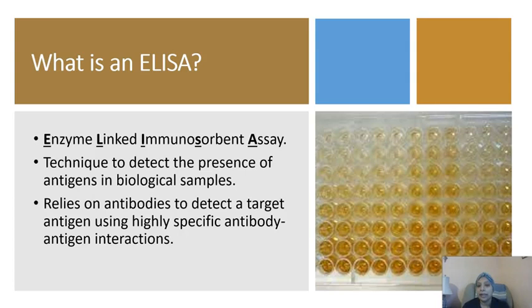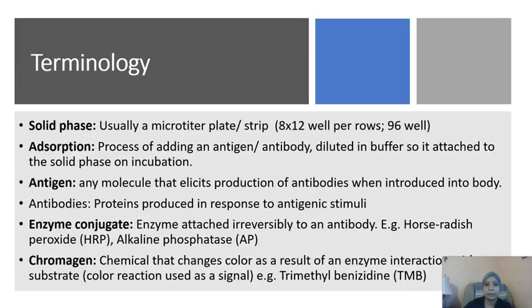We want to use very highly specific antibodies for this one to minimize cross-reactivity and to get better quantitative data. We can use specific types of monoclonal antibodies that are targeting a particular part of the antigen. So maybe just the amino terminal or the carbohydrate recognition domain, whatever it is that we really care about within that protein, to try to make it as specific as possible. It could even be against a phosphorylation state or an active state of the protein.